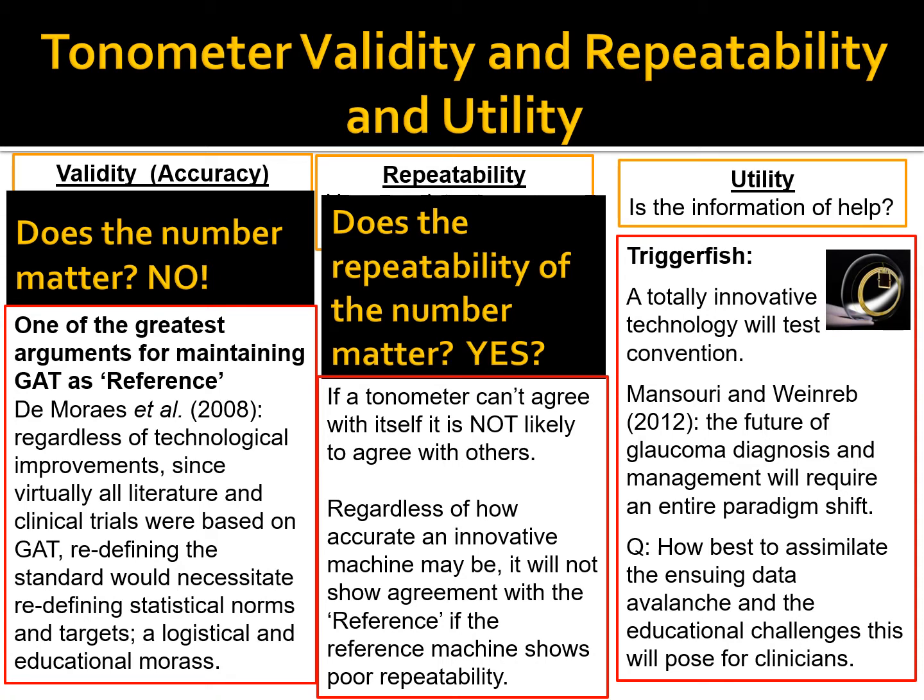Well, there's new technology out there. Triggerfish is a contact lens with a sensor in it, and it records 24-hour variation that is due to IOP. Now, these two authors, this came from Switzerland. There's also a Professor Elsheik at Liverpool Uni who's coming up with more as well.